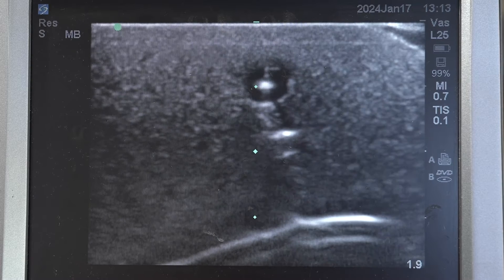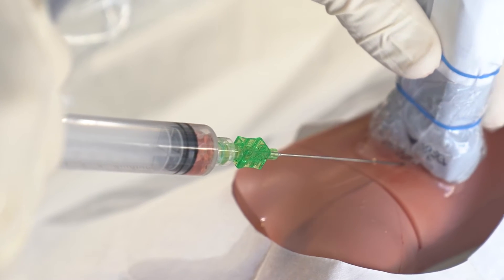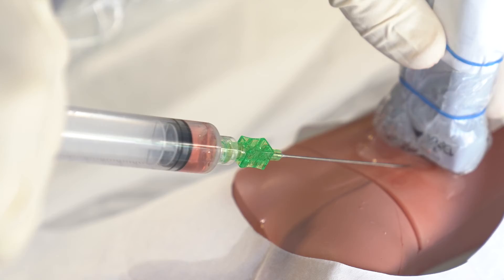Once the tip of the needle is visualized within the blood vessel and blood return is appreciated, hold the needle steadily in place.